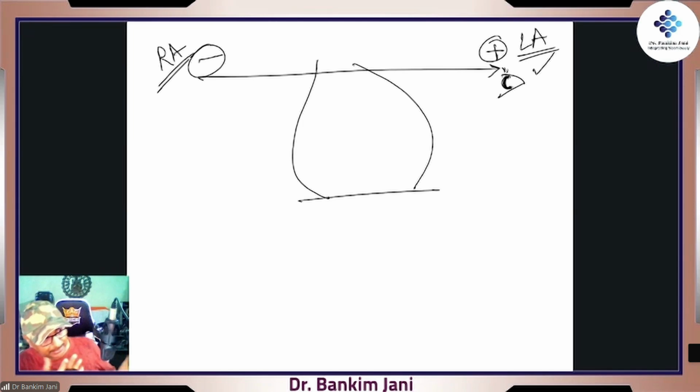You are watching signals that are coming towards me, but going away from me. If the signal is going towards this electrode, then it would be up, correct? And when it is going away, it will be going down.